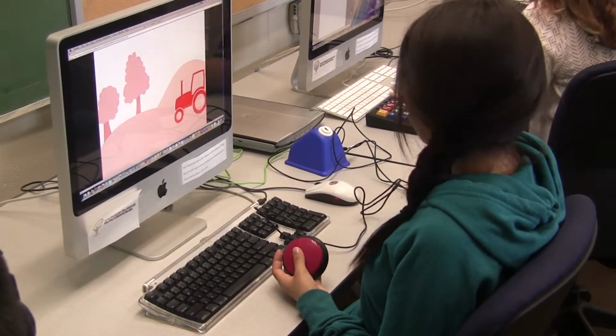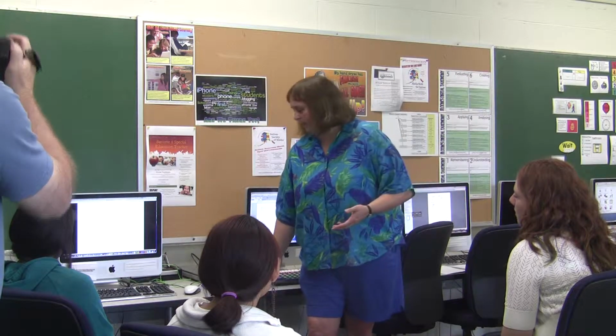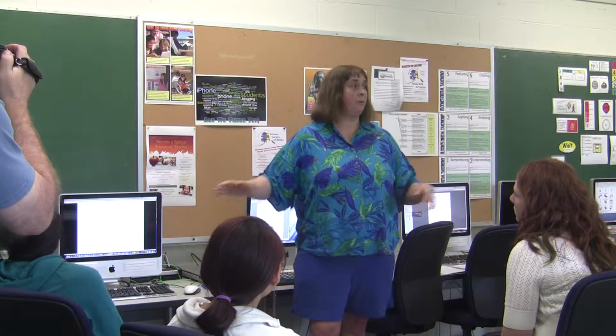And so it gives kids that don't have a whole lot of control something that they can do, something entertaining. And you can set up the switches so that they're working on their range of motion, and they're increasing their range of motion by reaching for the different switches.